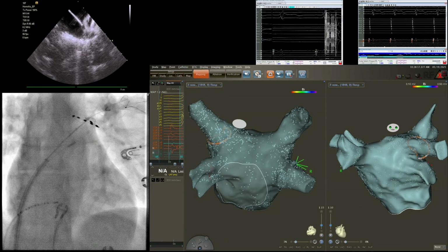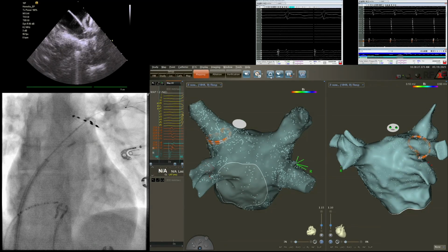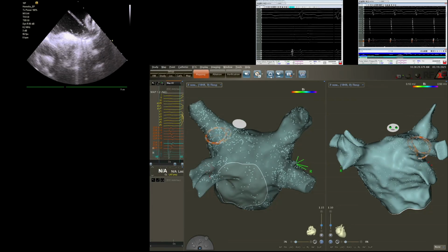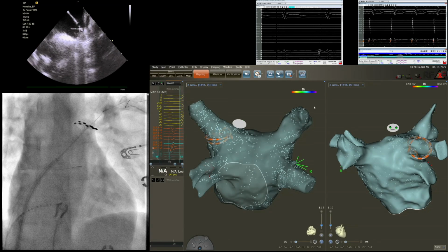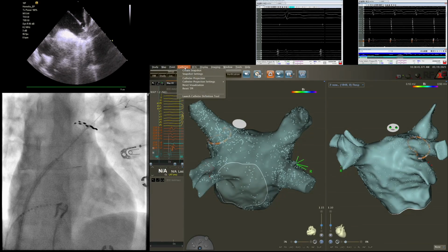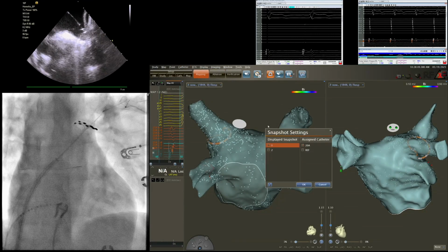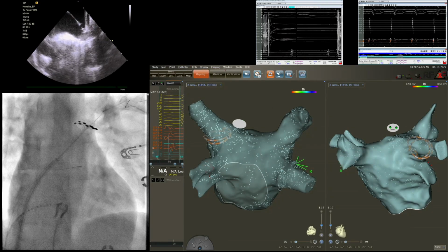1, 2, 3, 4. And now we will move the catheter, okay? So actually, we have a max ring. Now I will try to follow the catheter and rotate a bit, and actually it's fine. So like over 90 degrees rotation, and we are ready for the second series of pulses. Usually, I mentioned that we apply 8 applications per ostium, per side. And I don't want to be that deep.